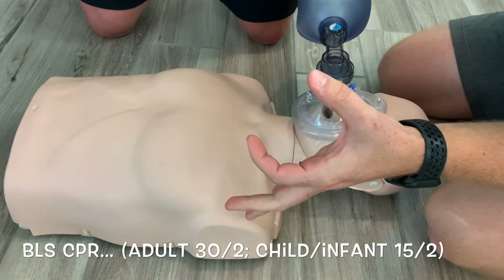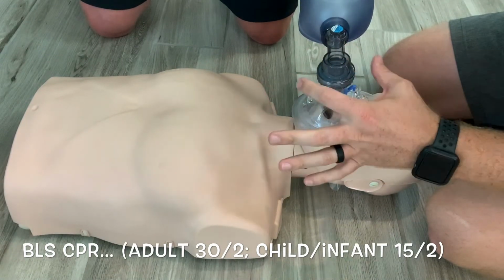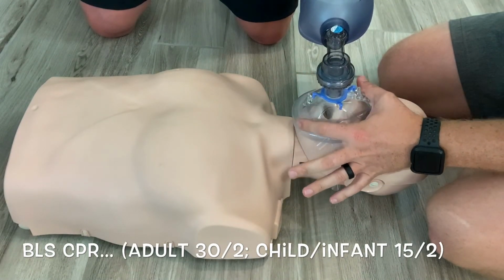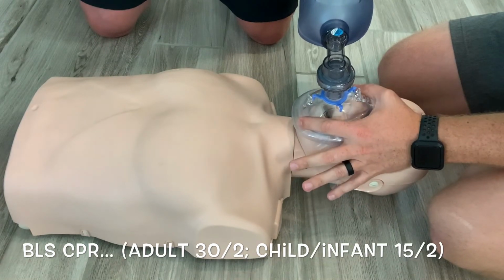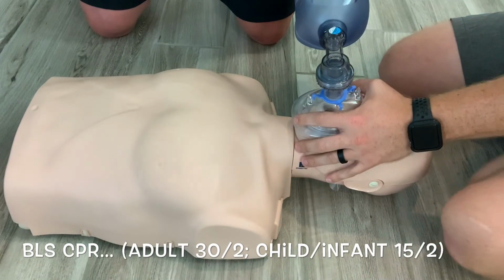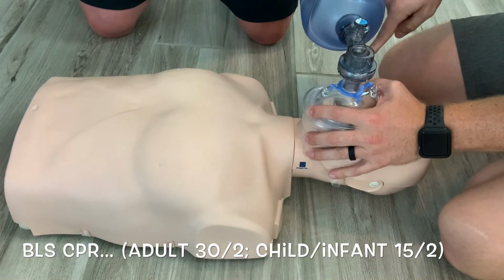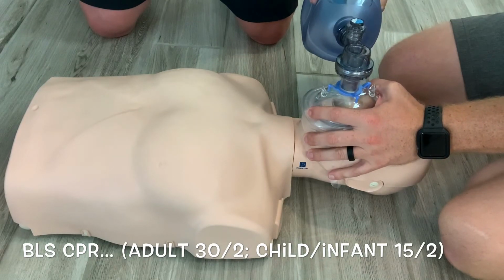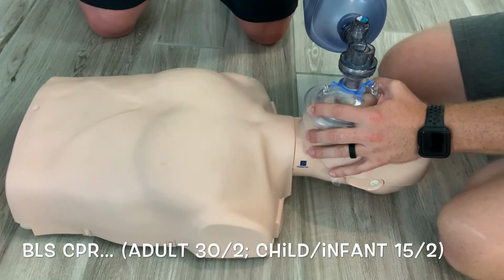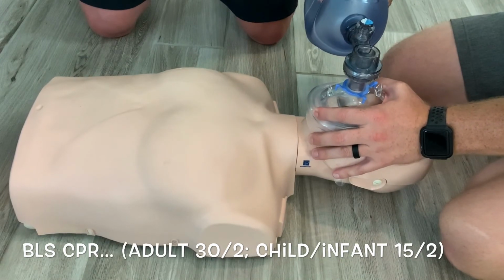And I'm going to perform what I like to call a C and E technique. The C is going to go across the mask to push this side of the mask down and seal it. The E is going to be used to grab the jawline and perform a head tilt. I'm going to take the bag itself and push downward on this side to actually seal this side of the mask. Then I'm going to squeeze this bag to perform 2 rescue breaths.